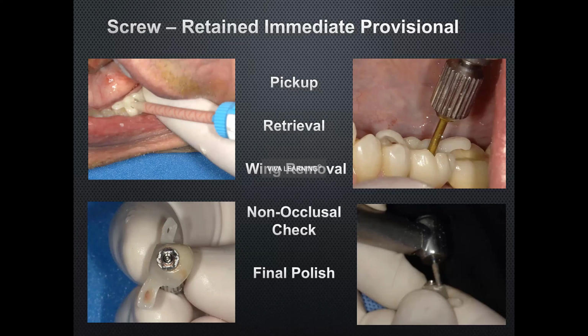If you read the literature, you'll see mentioned that on a typical case, you may have 5 different times that you would have this implant abutment interface bothered, by taking off your healing head, by taking off the provisional, by taking off the healing abutment. So if we can stay above that, studies are showing us that it's going to be easier and better for the tissue.